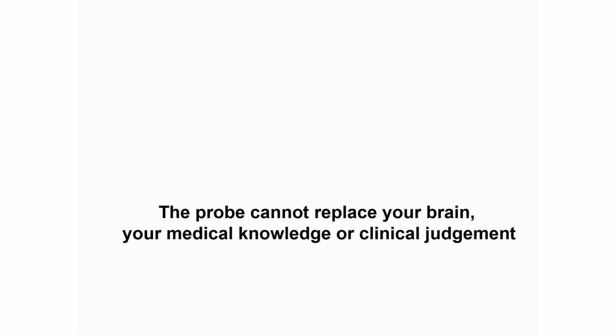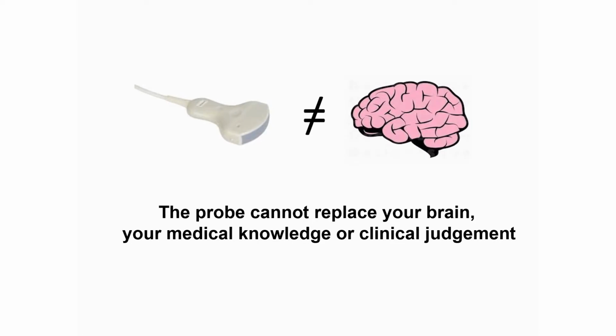It is crucial to recall that at the moment we have no clear data about the real diagnostic and/or prognostic value of this approach and scoring. So it is very useful to standardize the exam, but you should use the info with caution and always integrate the lung ultrasound findings with the overall clinical picture and other tests.